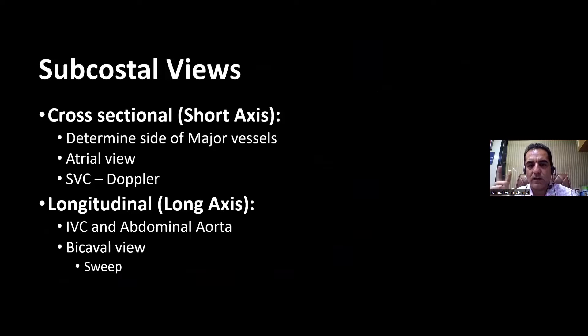Sub-costal views are again two: short axis and long axis. Just below the xiphisternum, pointer pointing at 3 o'clock, it will be short axis.